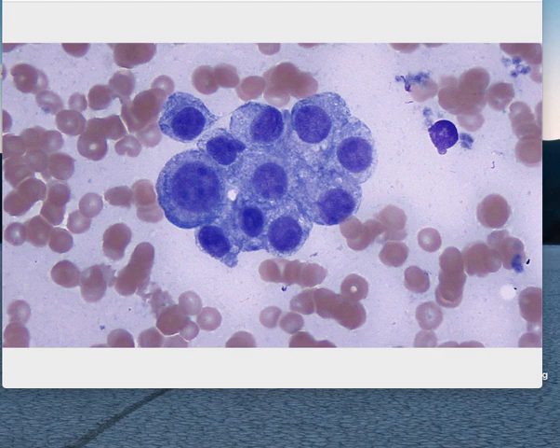And then once we've classified it as a transudate, modified transudate, or exudate, then we keep going farther down the chart to examine the sediment. Do we see intracellular bacteria? Do we have nuclear changes in our neutrophils, such as karyolysis and karyorrhexis? And then you keep going down here to non-septic, septic, degenerative, and non-degenerative. So it's really not that hard. Take your sample and work it down the chart. There's a little exercise to do that this week too. Okay, so make sure you look at that chart.